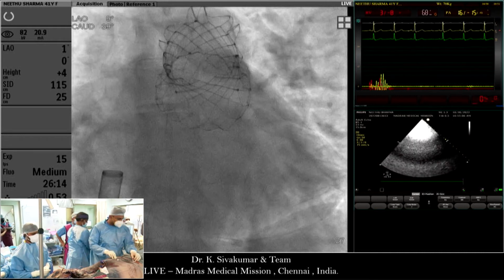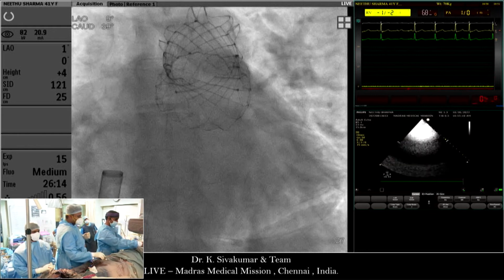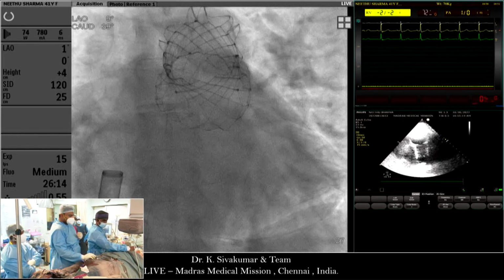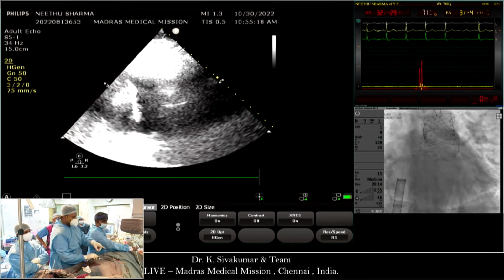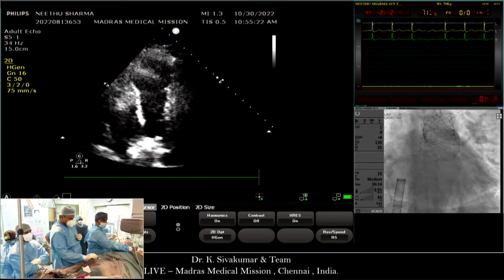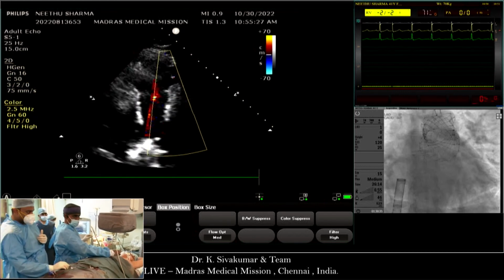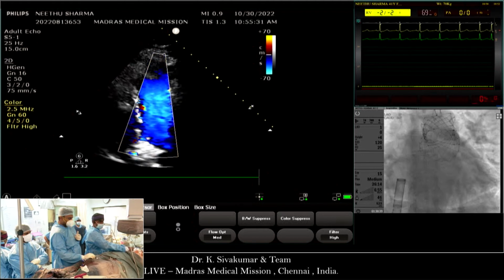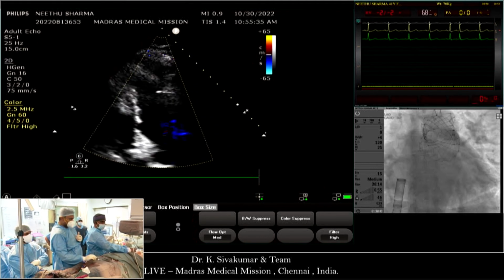We gave up using the coronary compression test in native RVOT because we put in a stent with large radial force, but we do the coronary compression testing with a semi-compliant balloon. So even if you don't see any coronary compression with the balloon, a self-expandable stent with radial force can cause it.